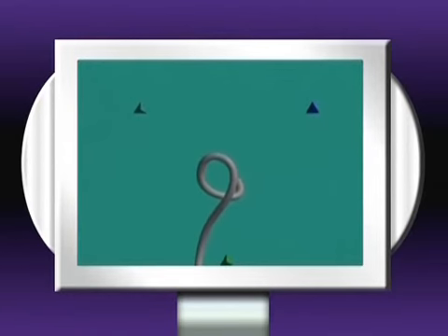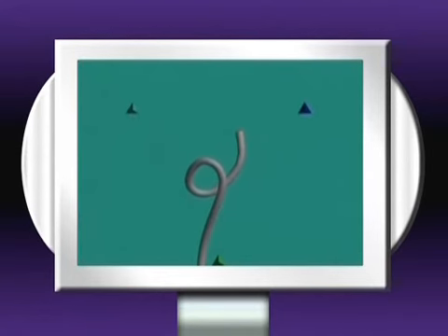Scopeguide 3D imager shows when a loop is atypical, such as this reversed alpha loop in the sigmoid. It's obvious that this is a counterclockwise spiral, so strong counterclockwise torque is needed during withdrawal to straighten the loop, rather than the usual clockwise twist.